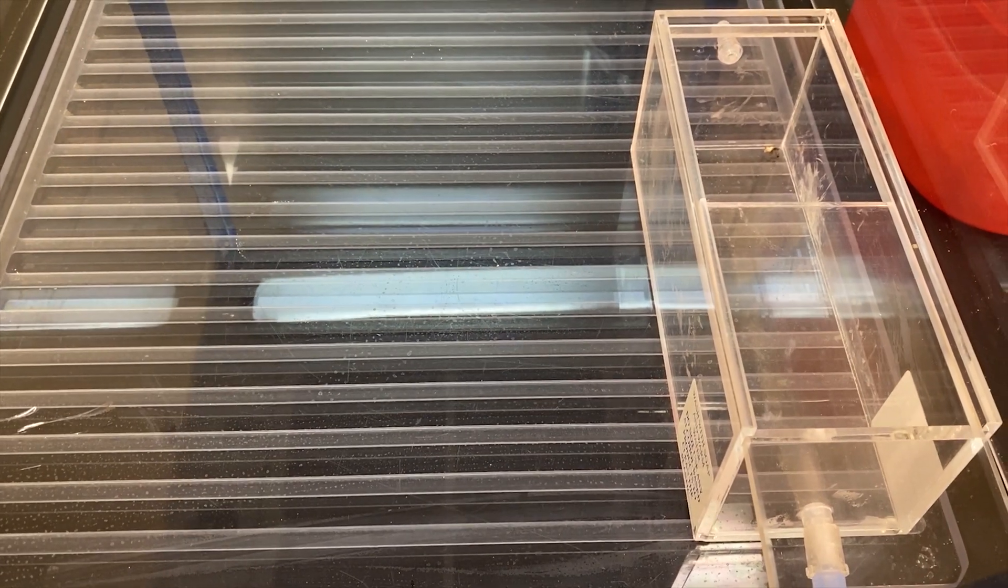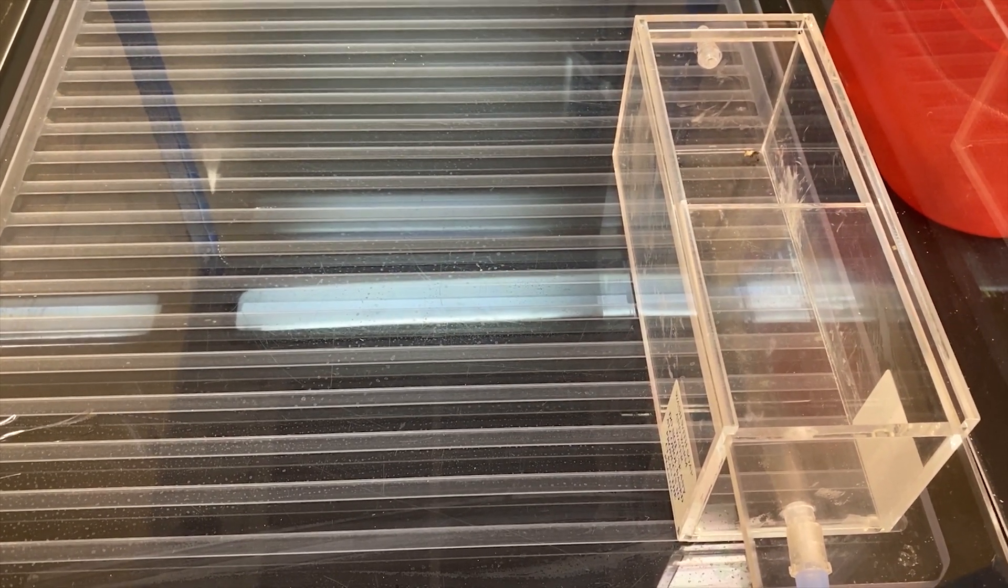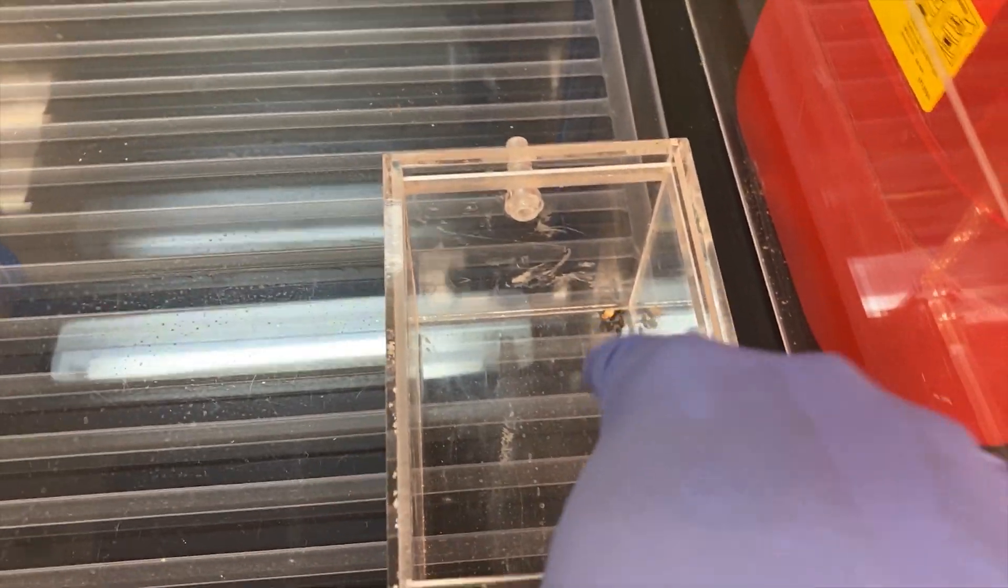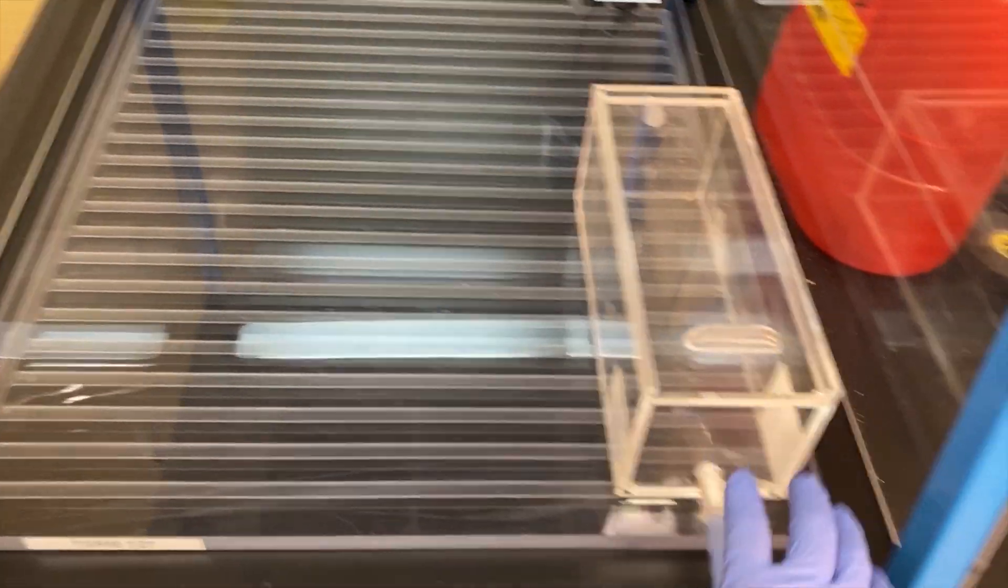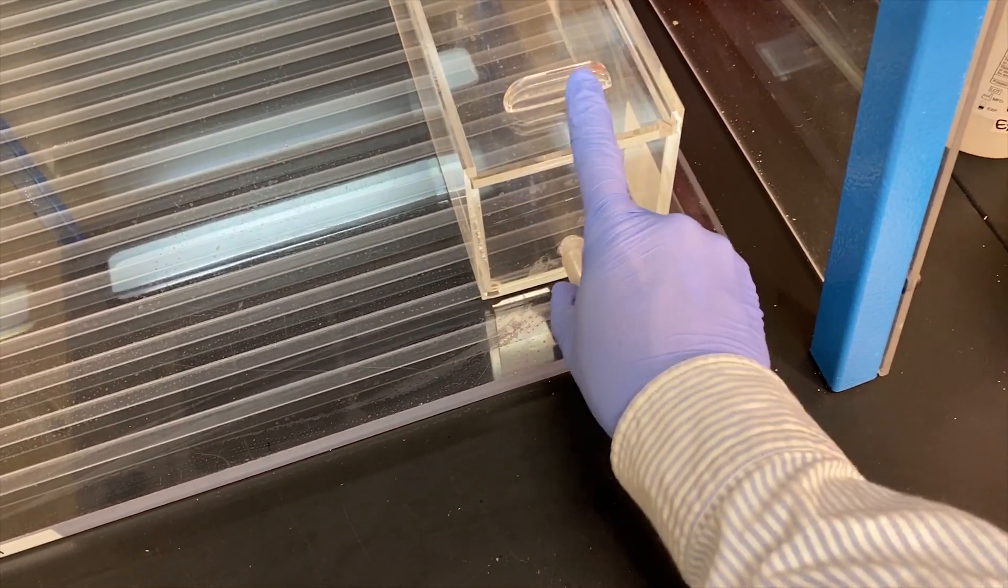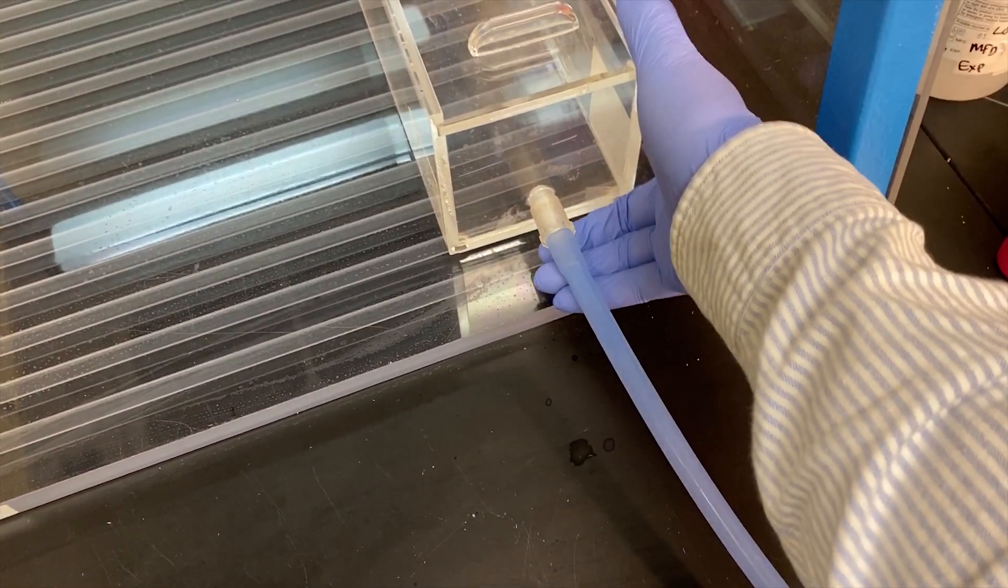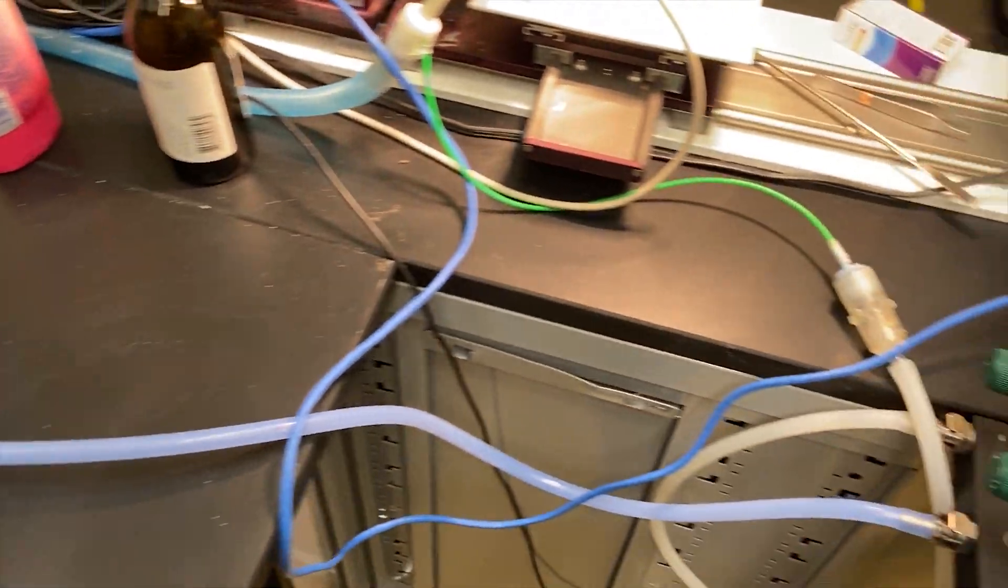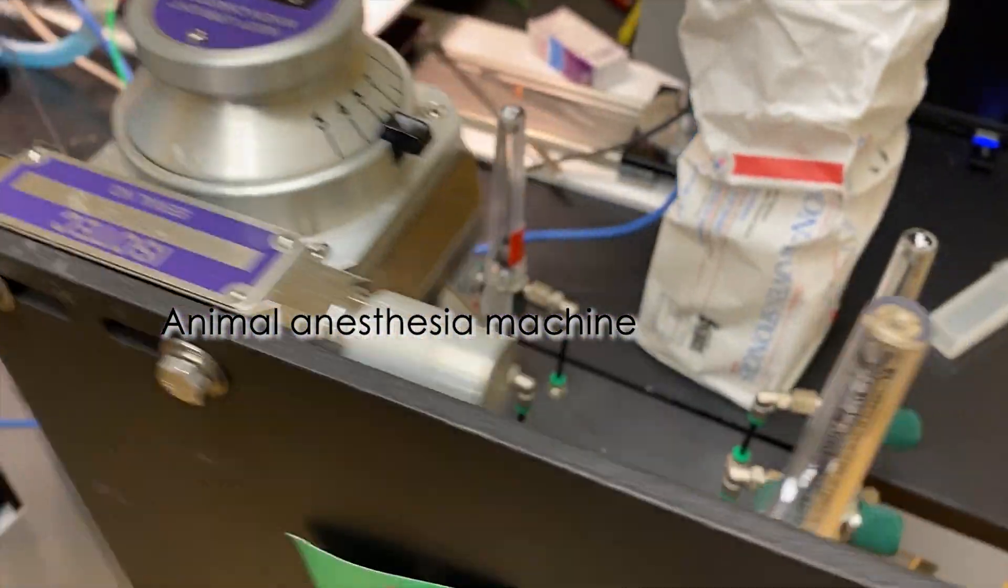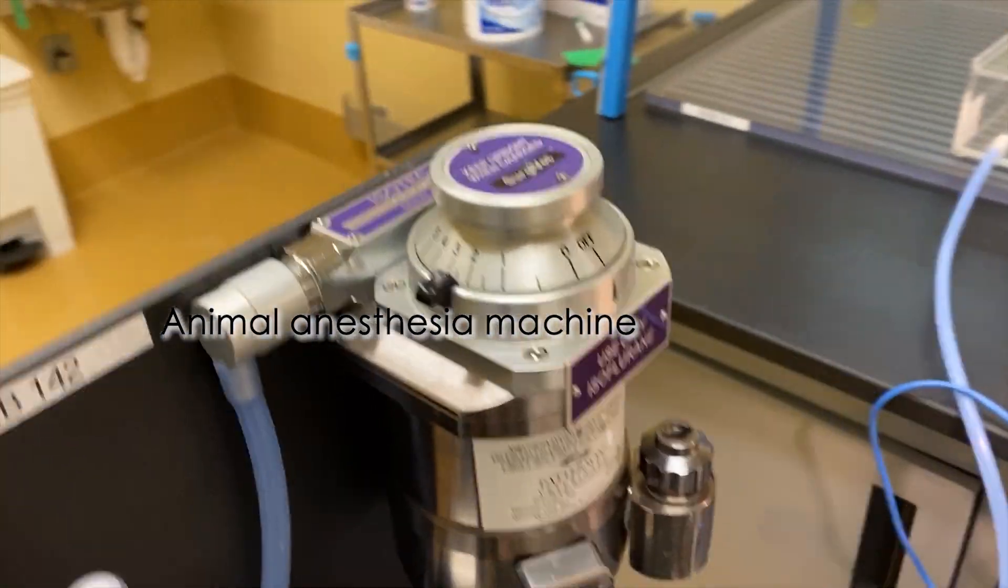And be careful, every time you use this cage, you must clean it. So you see, last person is not cleaning this cage, it's very bad. And here, connect the pipe here to the anesthesia device here.